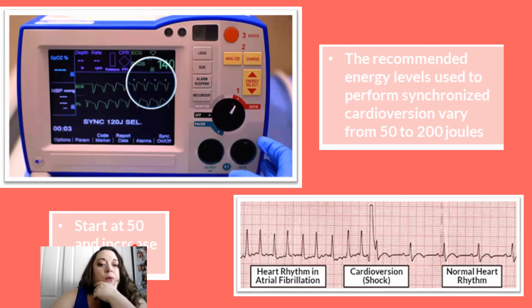All right. So what we do here is we'll put them on the pads, hopefully give them some kind of pain medication or sedative just to make them a little loopy for this. And then do you guys see the white circle here? These white dots above those beats let me know that the monitor has now synced up with my patient. So you start from scratch. I'm going to put pads on my patient. I'm going to turn this dial from off over to defibrillate. So that puts it in the mode that it can shock. And then down here where it says sync on/off, I'm going to hit on. And when I hit on, I'm going to start getting these white marks. And that lets me know, like I said, that my monitor has synced up with my patient's cardiac rhythm.